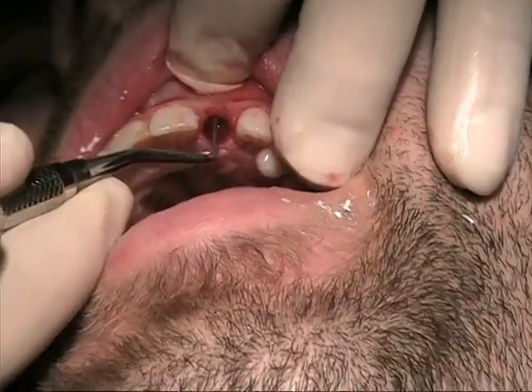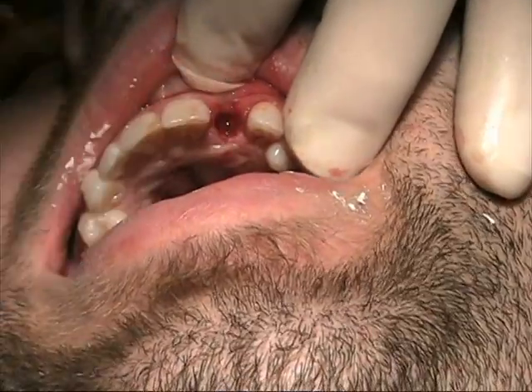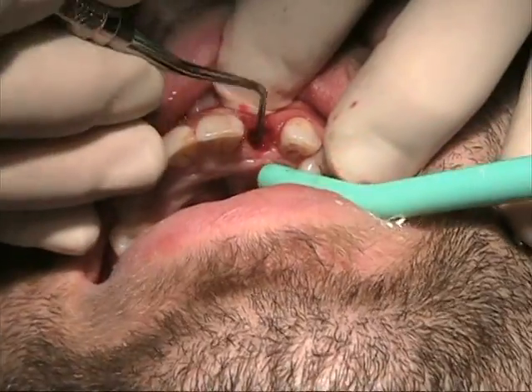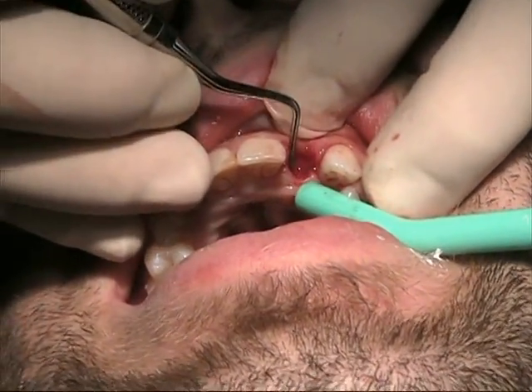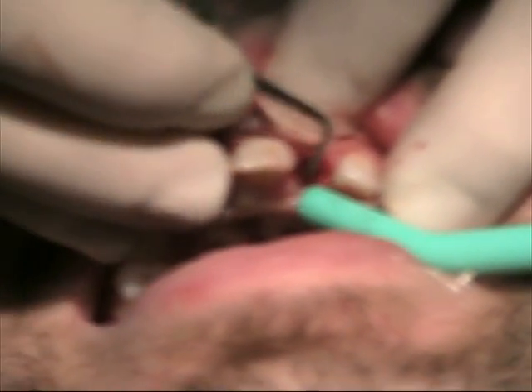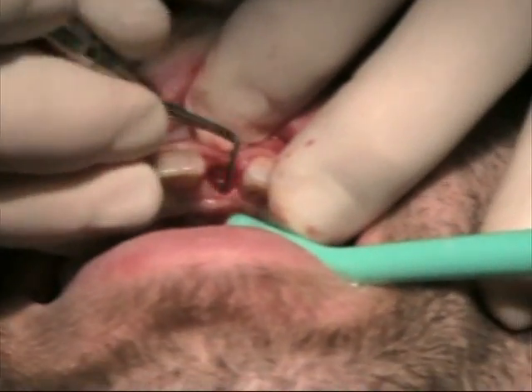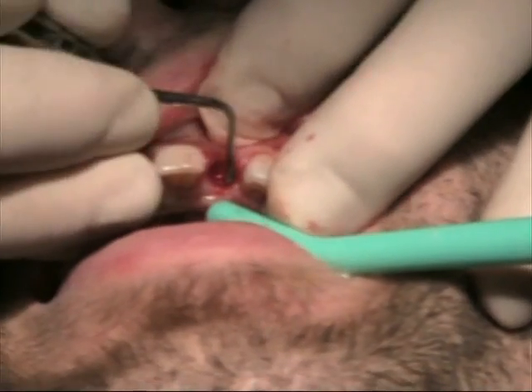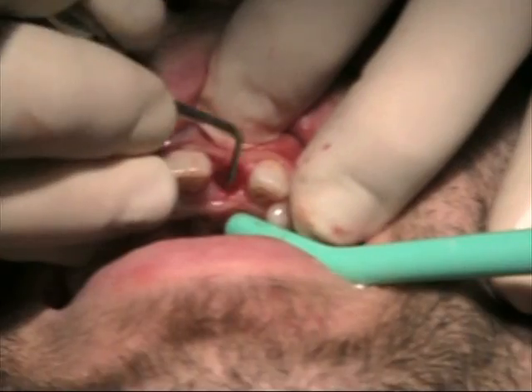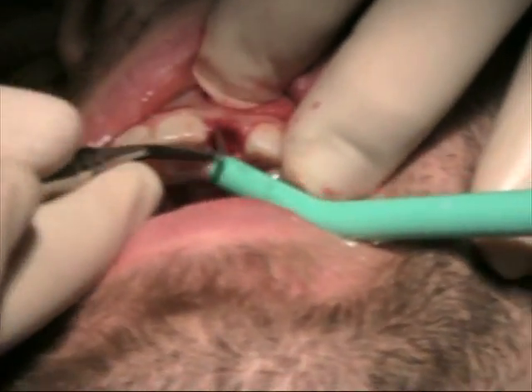We're going to slide in our acellular dermal membrane on the facial plate and put our graft material behind it, and then flip it over. You can see the defect where the root was here. What I use is basically pinning it between the existing periosteum and the alveolar bone itself, so we tend to elevate that tissue. You can use a number of different instruments to do this — I just tend to prefer the round excavator here. Our next step will be the replacing of the membrane and preparing of the bone graft material itself.